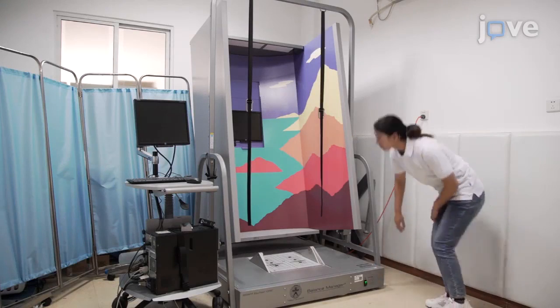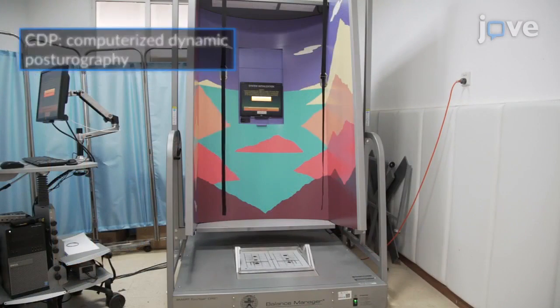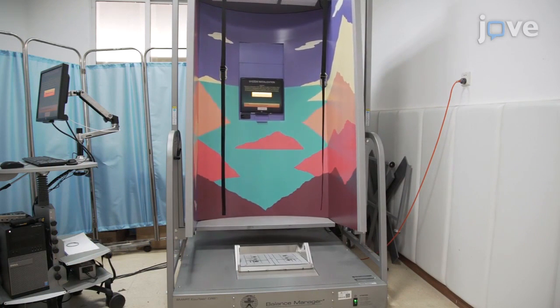Before beginning an analysis, turn on the CDP system and complete a self-calibration to confirm that the instrument is operating at a 100 Hz sampling frequency.